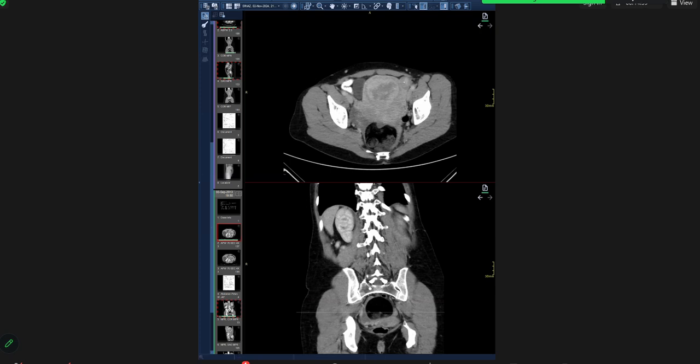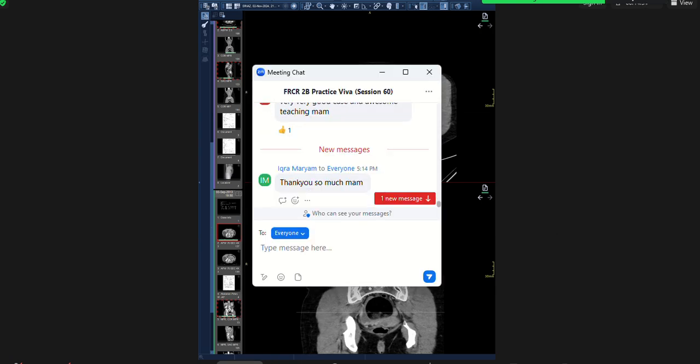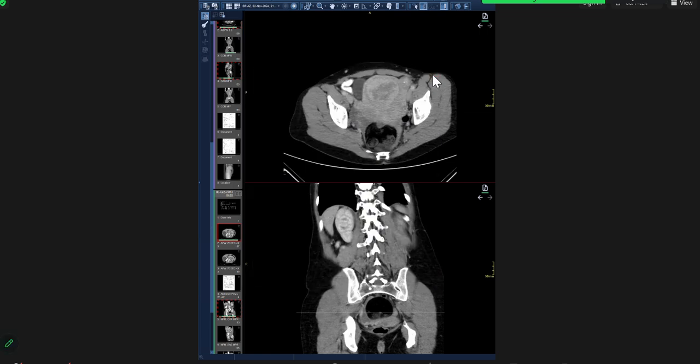Any other question with regards to acute abdomen? Does anyone have any question for it? Because that is one thing that we really should know how to manage. Okay, it's okay if you don't know the diagnosis every time. It doesn't mean that you're going to fail, but as long as you can tell them the transition points, you can tell them it's ileus, you can tell them it's mechanical obstruction, I don't see the cause, but this is what I'm going to be doing.